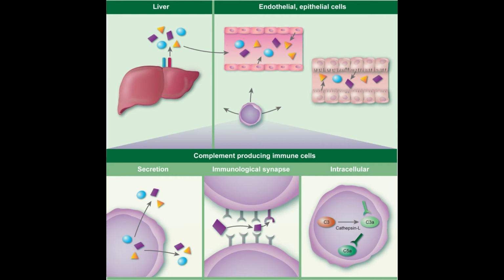If patient antibody is present, it will combine with the reagent antigen and complement will be bound. The test can also be performed with reagent antibody to detect the presence of antigen in the sample. The second step involves adding sheep red blood cells that are coated with hemolysin.